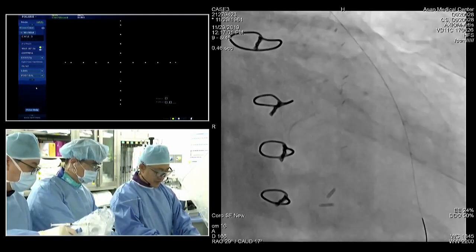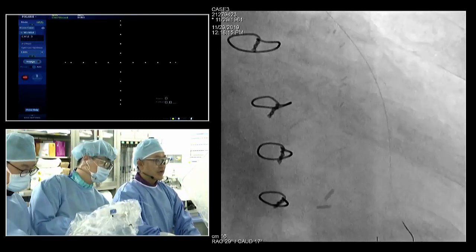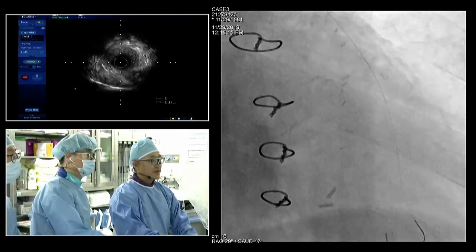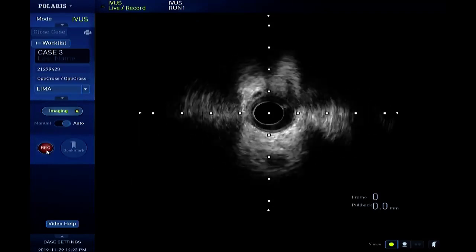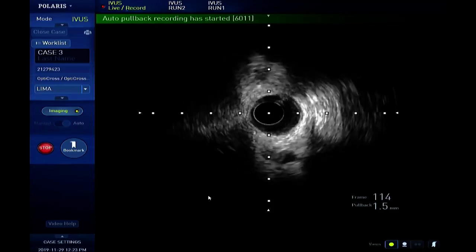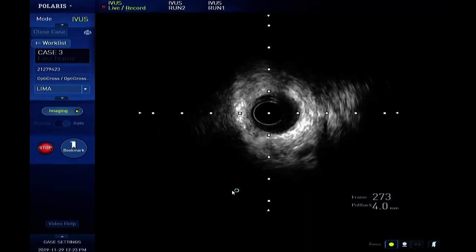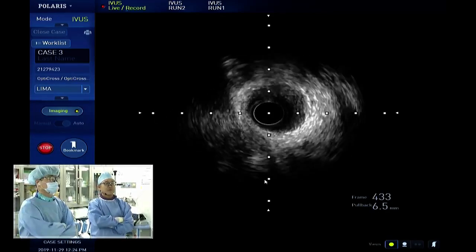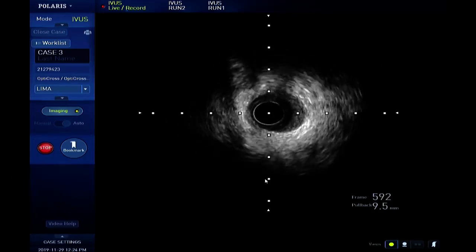Definitely. If we put a stent, after balloon angioplasty, at this moment I'm going to check the IVUS again. So some people in the panel may consider doing a drug-coated balloon. Actually, PCI is an imagination thing. Anyone in this situation will try a retrograde approach to open up the native LAD, native left main. But I think the mammary looks pretty good. It looks good, but unfortunately they failed in 9 months on both sides. That's what I worry about. The surgical result might not be as good or as long-lasting.